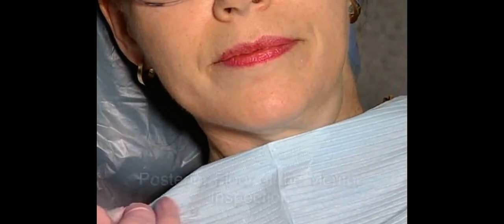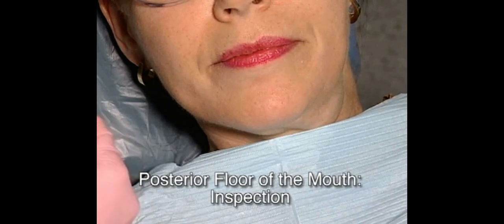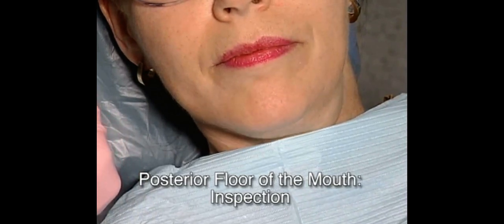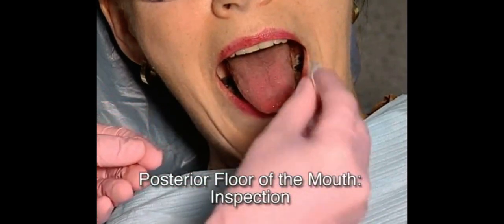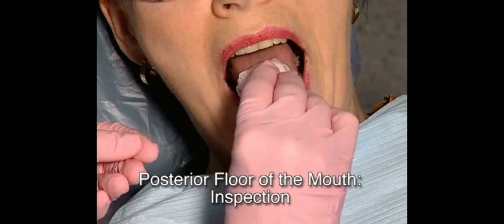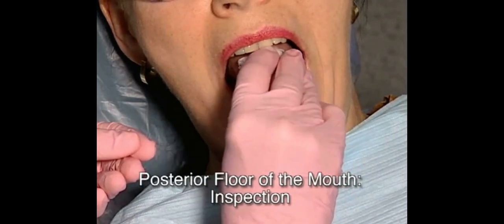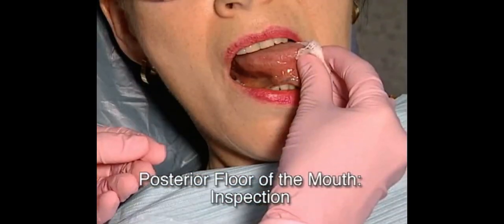Next, inspect the posterior region of the floor of the mouth. Ask your patient to assist you by relaxing her tongue and protruding it slightly. Fold a damp gauze square in half and grasp the tip of the tongue between the sides of the square. Use your right hand to pull the tongue gently toward the left commissure.